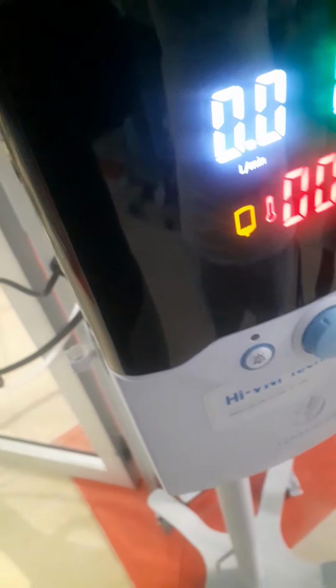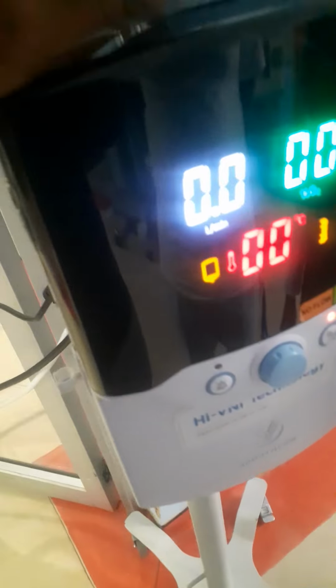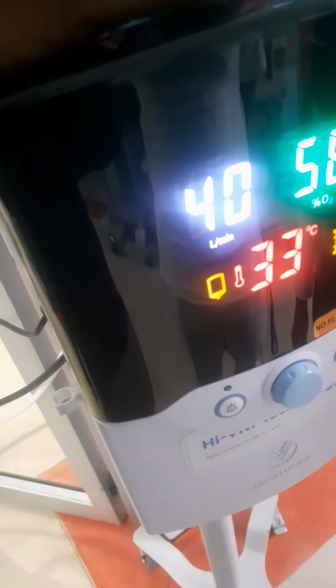That's when we already have the humidifier inside here. With this machine, even if you are at the lowest flow, you will still get humidification, because it's already humidified. But when we are at 2 liters, we don't really need it because it will be moderated already. It's not high then. The patient doesn't need the high flow anymore, because 2 is too little. You won't even feel anything.